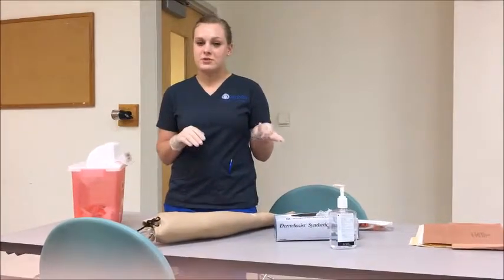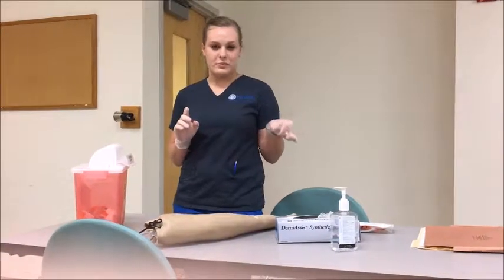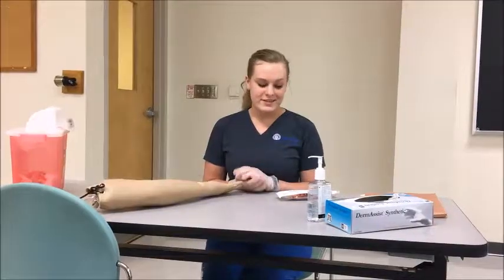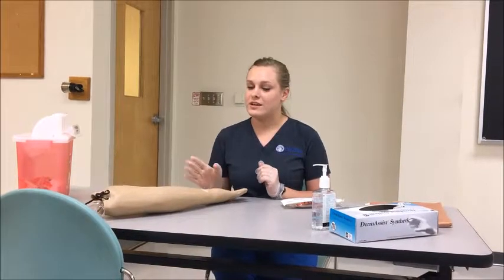Two non-invasive alternatives could be placing a pulse ox on the patient or using a capnometer. But for this patient, we needed more information like a blood gas, so I'm doing an ABG. Certain risks and precautions include getting an embolism, hematoma, bleeding, and infection. Also, if the patient's oxygenation or ventilatory status has changed, you have to wait 30 minutes prior before taking an ABG, as that could affect the sample.